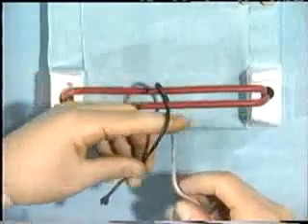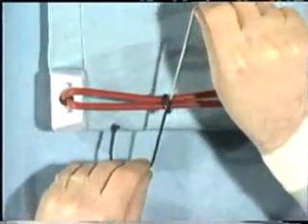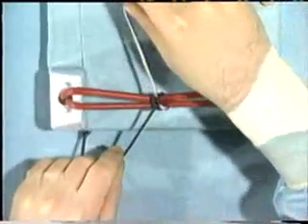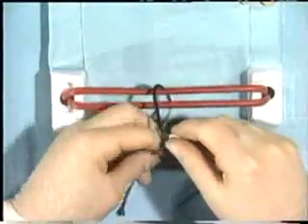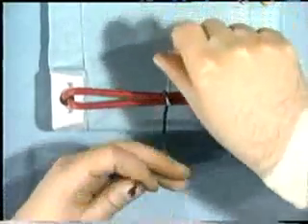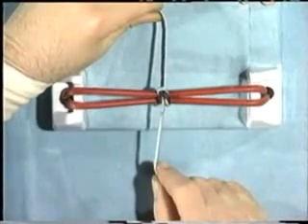Here we see an index finger knot being correctly laid, and a middle finger knot being correctly made, but the hands not crossing. And again, we don't end up with a reef knot. Let's therefore remind ourselves of the correct way. Index finger knot. Crossing the hands. Middle finger knot. Crossing the hands again, and here we see the reef knot.